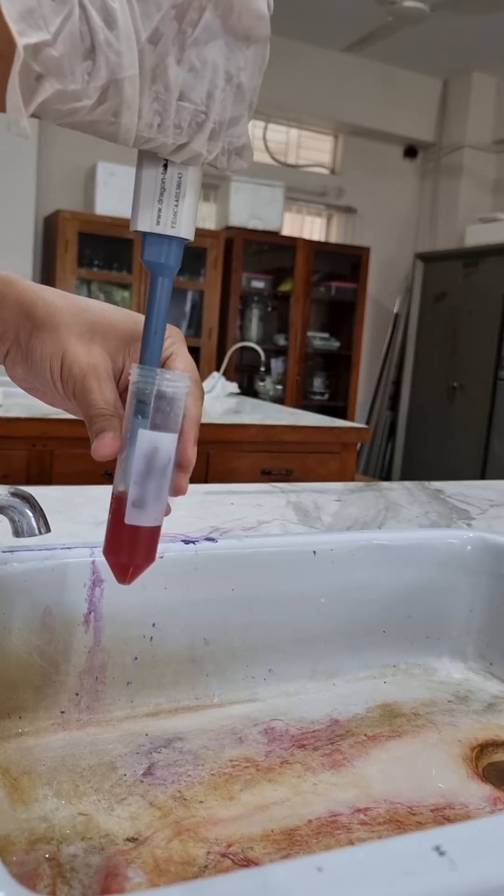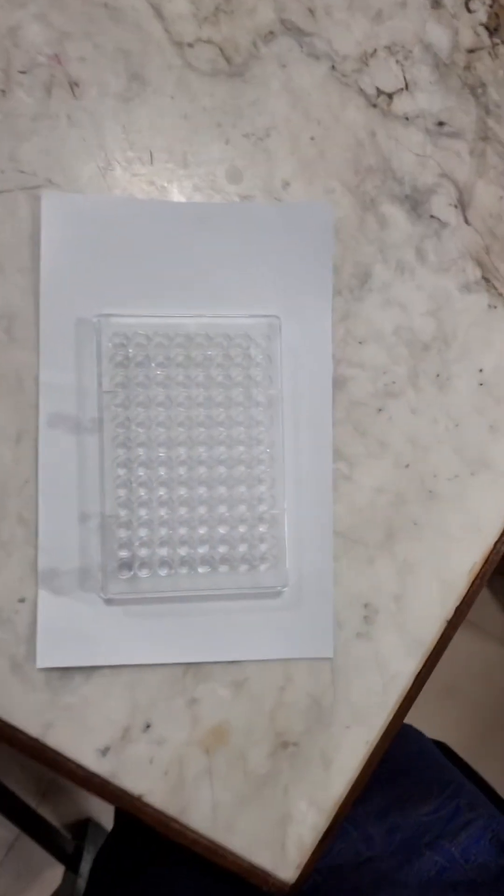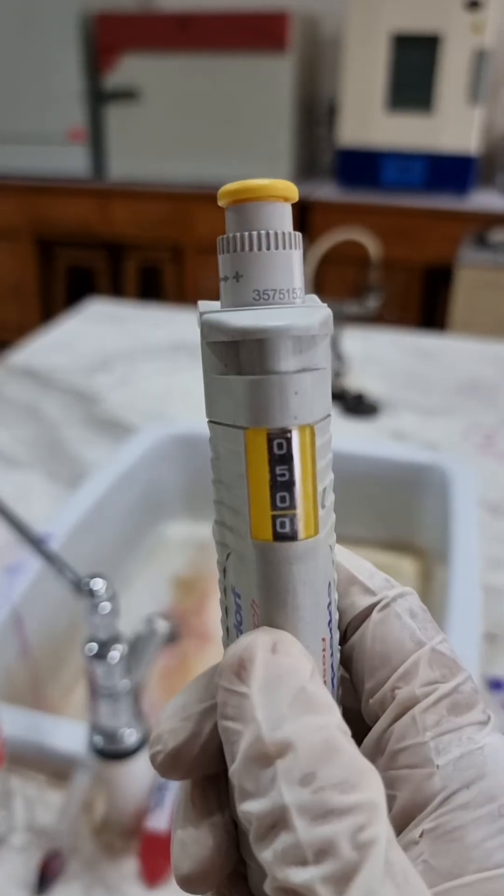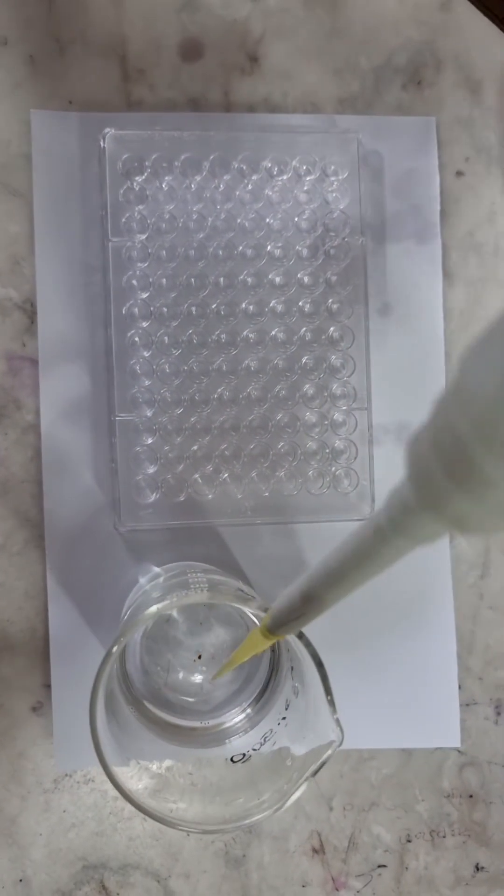This is our one percent RBC and now we are ready to do the HA test. First, we take a 96-well microtiter plate, then we are taking 50 microliters of PBS in 12 of those wells.